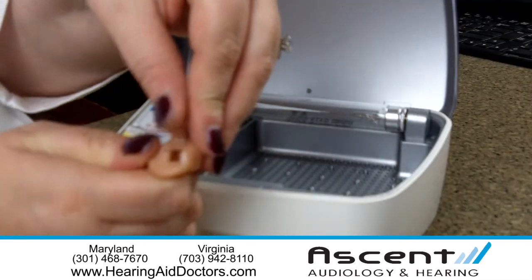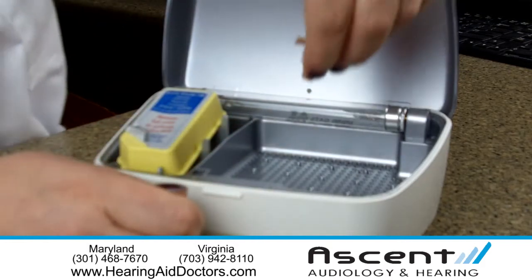Next, you'll take the hearing aid and wipe any excess wax from the hearing instrument. You may leave batteries in, but open the battery doors for air circulation.